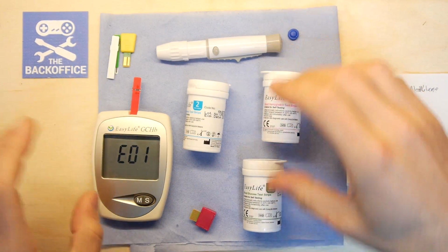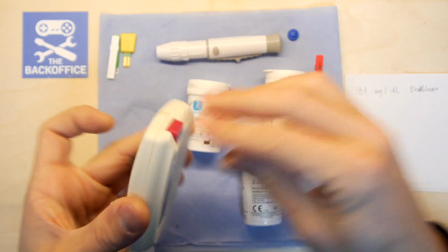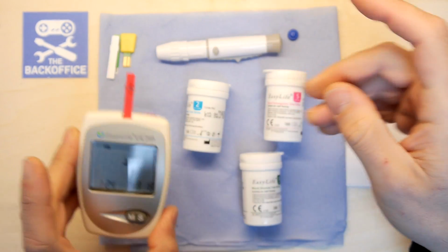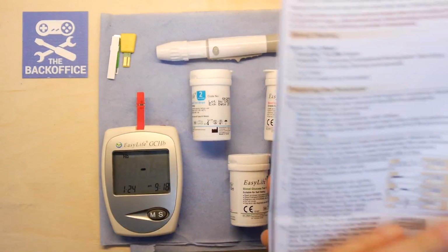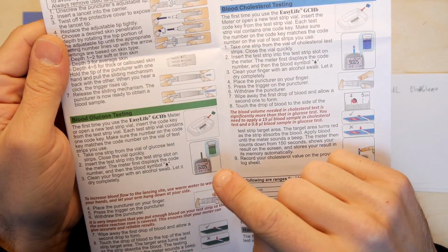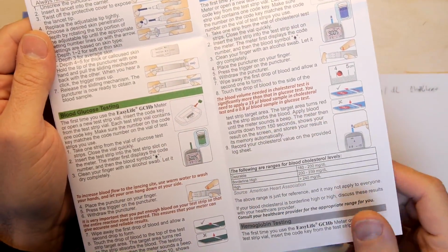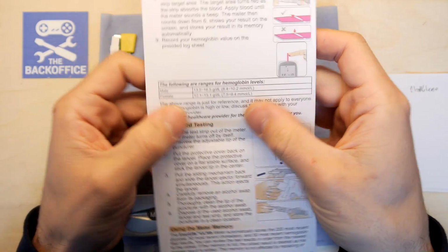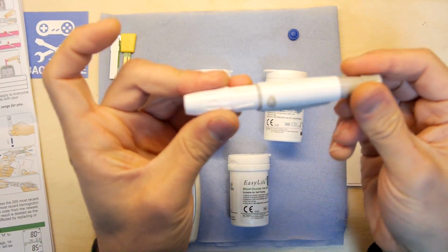Pop that in. Error 01. Great. I've got the chip again. This is good, really. It really stops you from screwing up. 8564. Pop that in. It's all good in the hood. Right, so what does this one say? How much blood do you need for the hemoglobin test? For the blood glucose test, you needed a tiny bit, right? For the cholesterol test, you needed 15 versus 0.8 for the glucose. The hemoglobin doesn't really say, just gives you where you want to be for male or female. Let's just puncture it and roll with it.